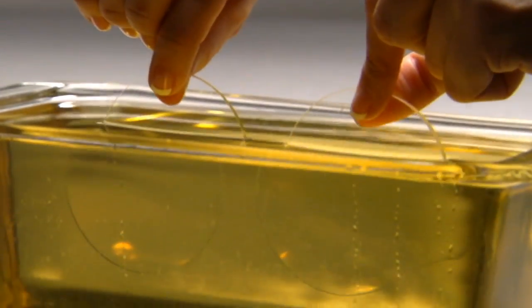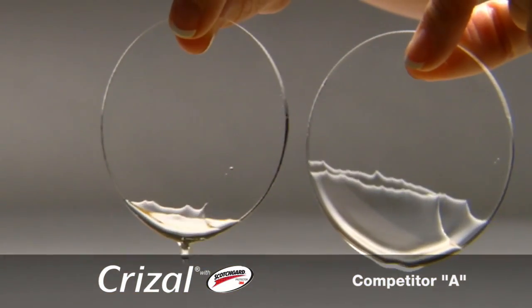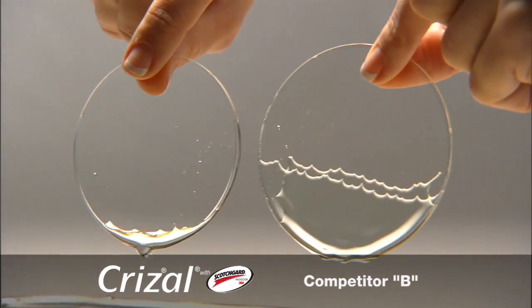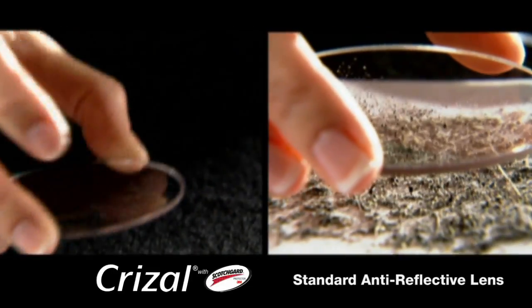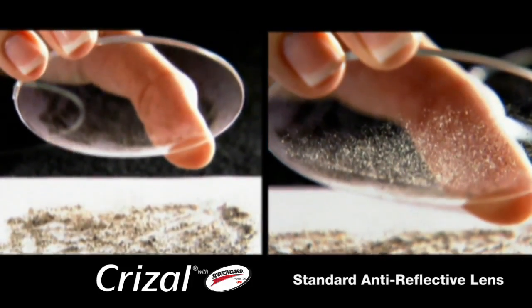As demonstrated with this oil dip test, Chrysal lenses with Scotchgard Protector have a slippery topcoat, which makes them easy to clean. Watch how quickly the oil runs off the Chrysal lens with Scotchgard Protector compared to competitive lenses. Watch how a Chrysal lens with Scotchgard Protector does not attract dust or lint due to its unique anti-static properties.